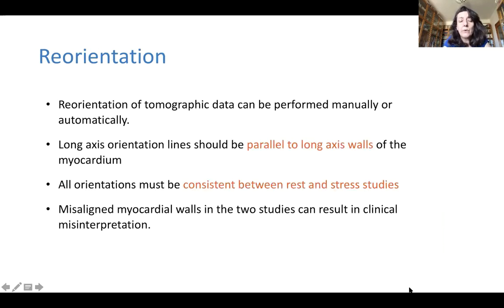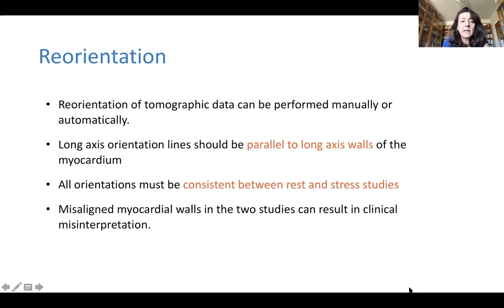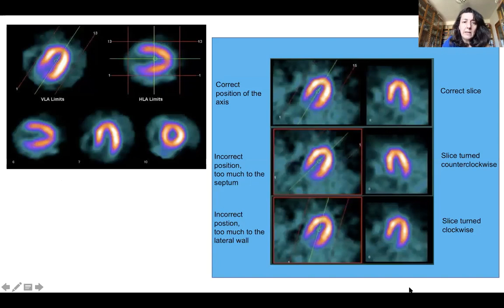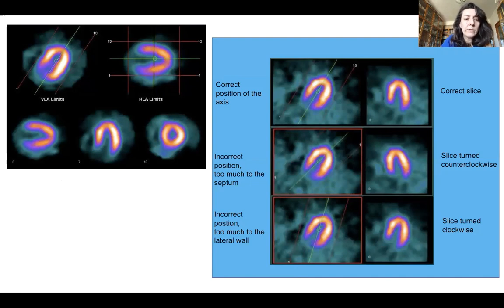Reorientation of the tomographic data is very important. It can be performed manually or automatically, and it provides the best way to analyze your data, which should be consistent between rest and stress. The long-axis orientation lines should be parallel to the long axis walls of the myocardium. If you misalign the myocardial walls in the two studies, it can result in clinical misinterpretation and introduce many artifacts.